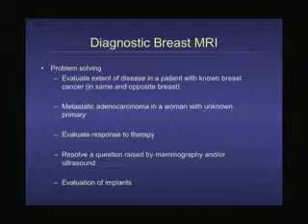Evaluating response to therapy. How is that tumor responding to chemotherapy? We can assess how it's taking up that contrast to determine whether or not it's responding to the chemotherapy, whether or not we need to change the chemotherapy somewhere mid-course.